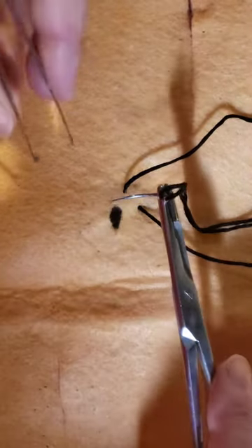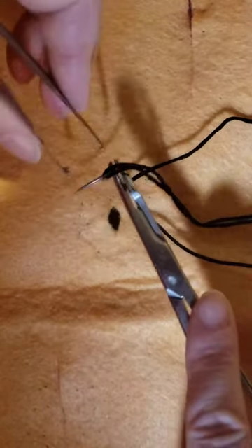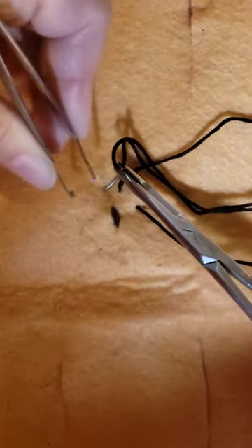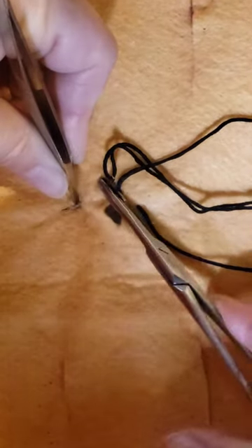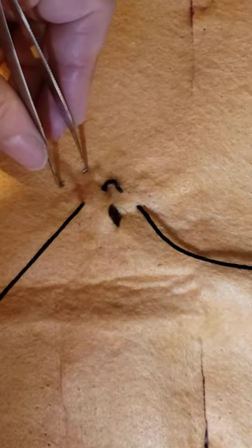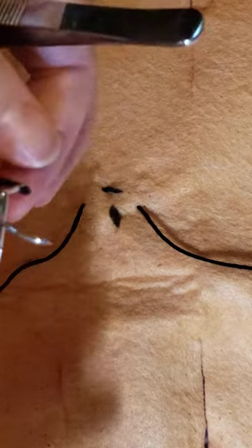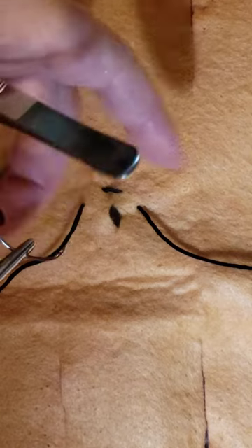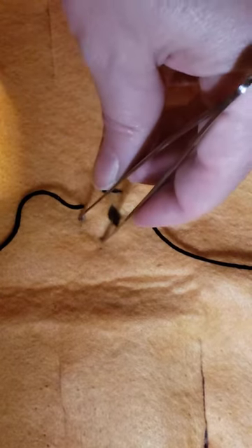Okay, you may have to re-grasp your needles at different angles depending upon where you are along the circle. For now, I still have it the same way I started. I'm going to move over just a little bit and bring my needle in and out, taking my second bite. Okay, this time I'm going to go ahead and turn my needle around. And that's just because normally, like say you're suturing a rectum, it's going to be upright in front of you. So you won't, again, be able to flip your patient around.